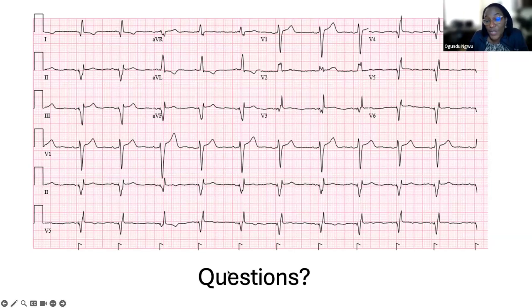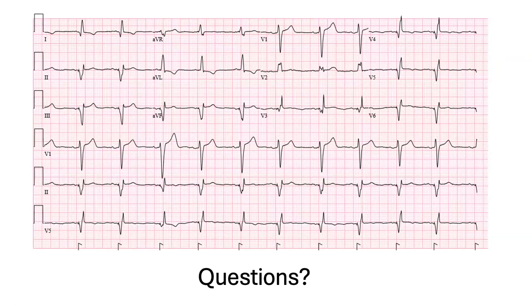Sometimes when you see this in the office, it's really a difficult thing to deal with because the patient is already home. And as AJ said, you have to take a deep breath, roll over, do all sorts of things to try to replicate it. So you just have to find a way to get around it without having to go back in to revise the whole system.